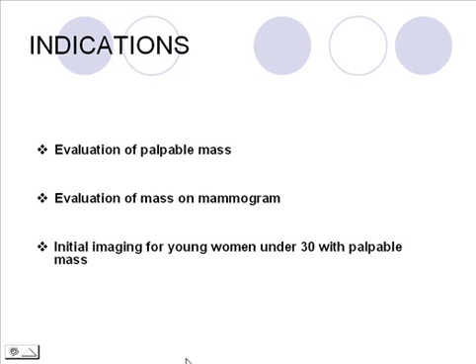When a woman comes into our breast imaging center and has a palpable mass, whether it is or is not seen on a mammogram, we always do an ultrasound. We do evaluation of a mass on a mammogram.